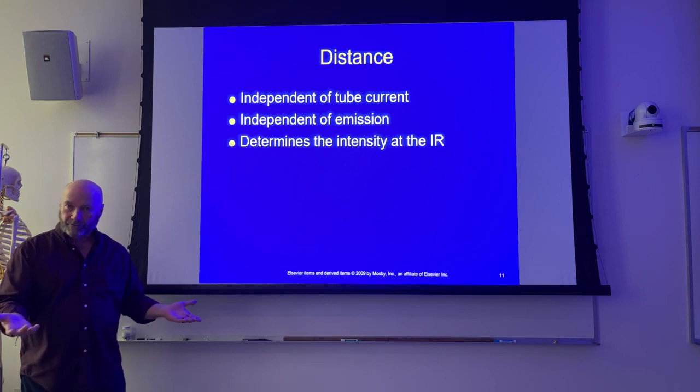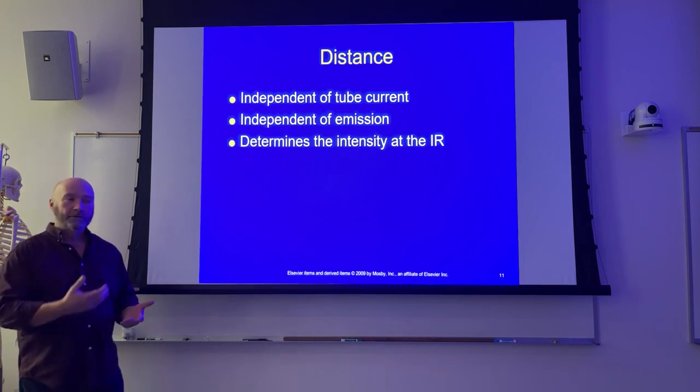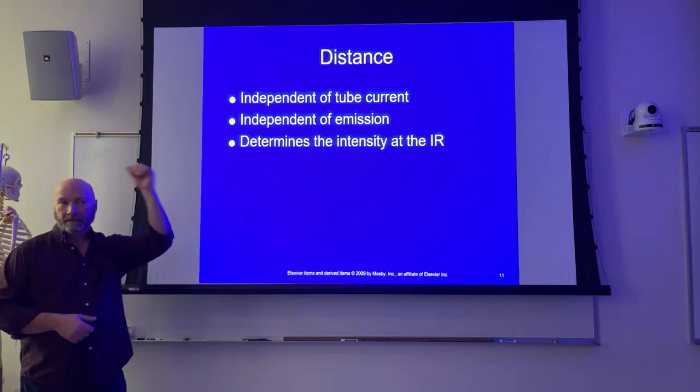You had to shoot them supine, 40 inches, and then you go back in today and the patient is better, and you can back up to 72 inches. Okay, you're gonna use the same technique? No, you're not. All right?